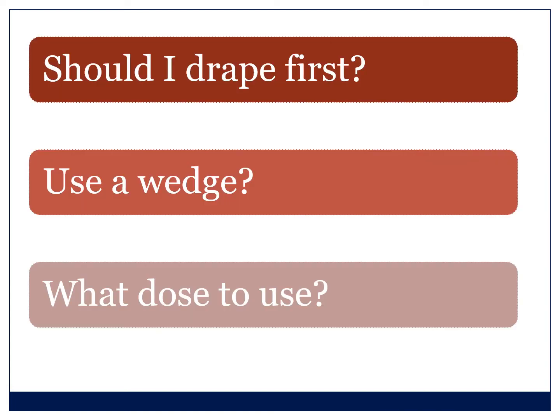And these things should be easily available for your staff. So just before we get to actually the induction of anesthesia, here are a few questions that I often get. Should you drape the patient first and then induce, or do you induce and then drape once you've secured the airway? My answer to that, there are actually good arguments on both sides, is that you probably shouldn't put a screen in front of the airway if you're an occasional anaesthetist. So whatever else you do, don't put that screen up with drapes on it just in front of the patient's face, because when you get into trouble, that can make it more difficult.